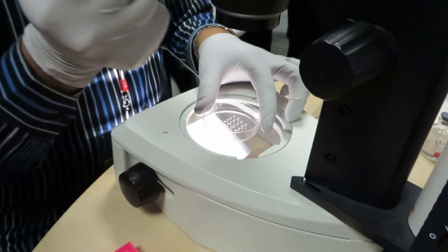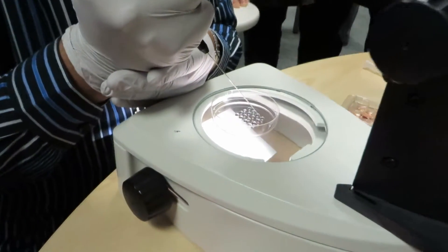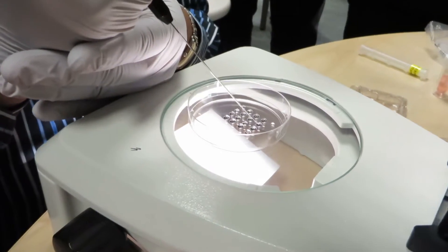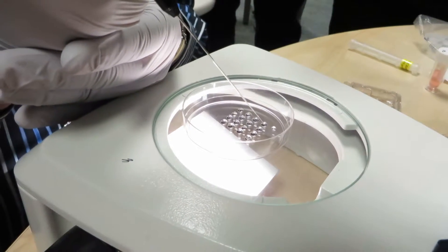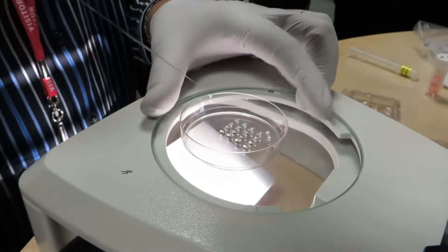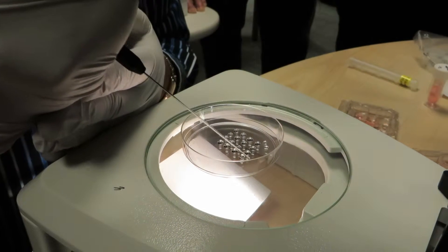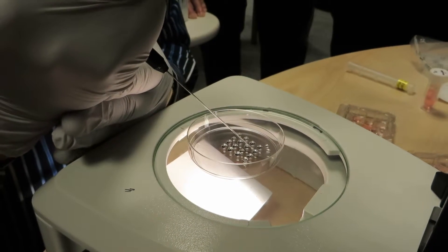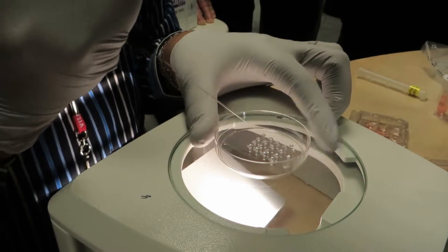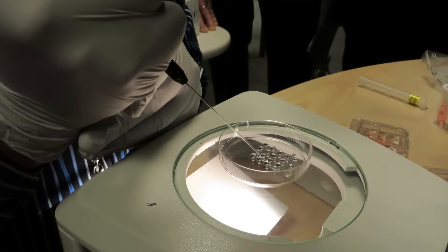You pick your cell — and we'll refer to this as a cell rather than the embryo. Release it in the first drop, empty your capillary totally, then prime it from the second drop. Put it in the second drop and empty your capillary again. This whole process is to reduce any kind of carryover contamination. Wash, prime, pick the cell up, wash again in the third drop, empty the capillary again, then prime the capillary with fresh solution from the fourth drop.